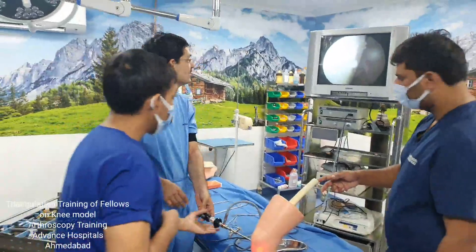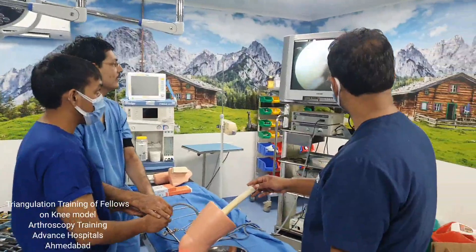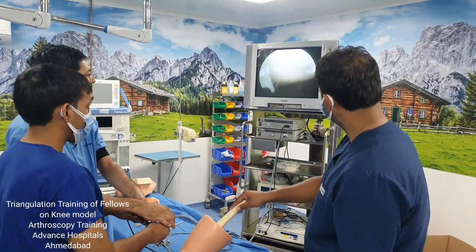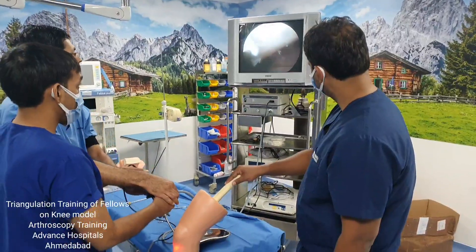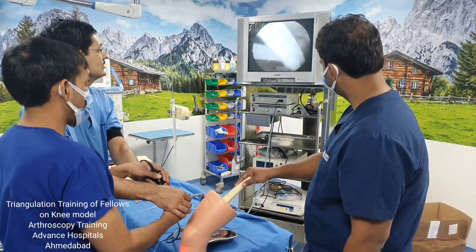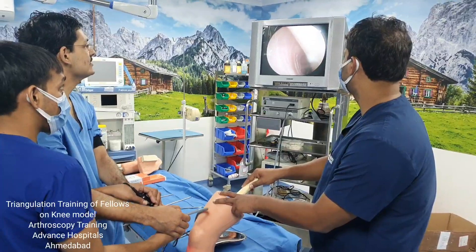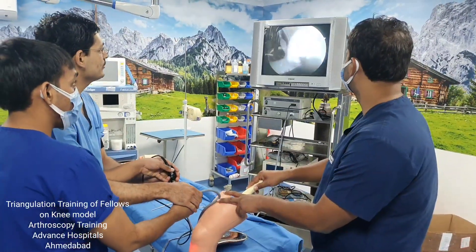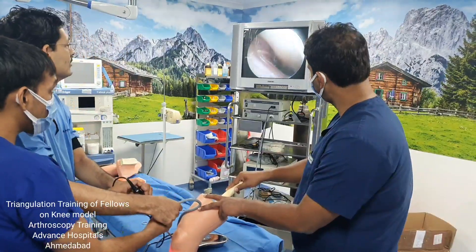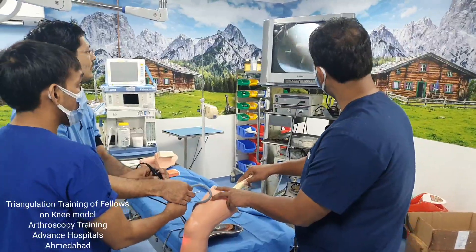We can see the knee joint as it is usually visualized. You can see the skin texture here, and the consistency is almost similar to that of a real knee joint. The knee joint is very nicely visualized here. This is the medial femoral condyle, this is the tibia, and this is the notch — you can see the notch right over here.